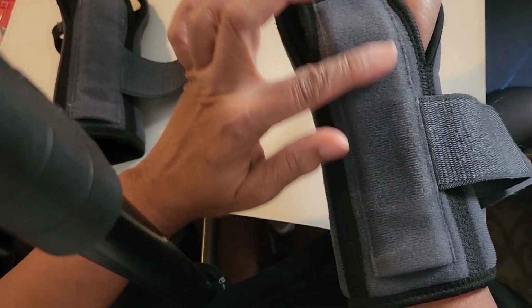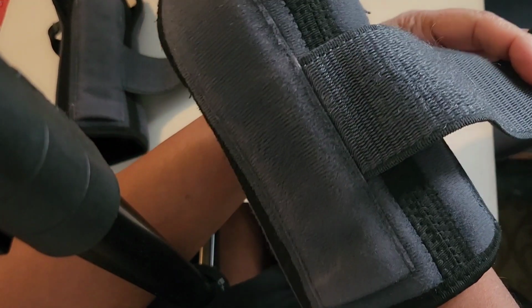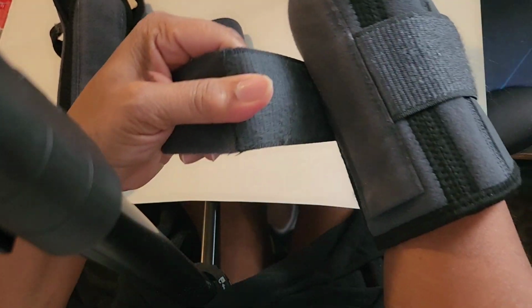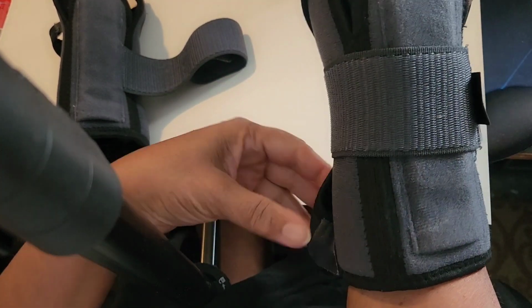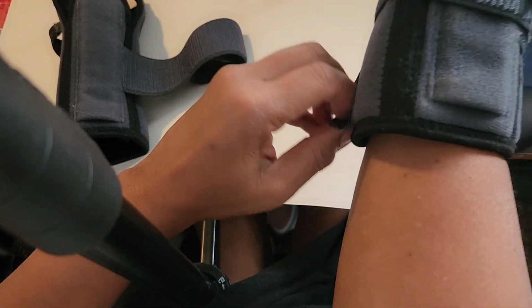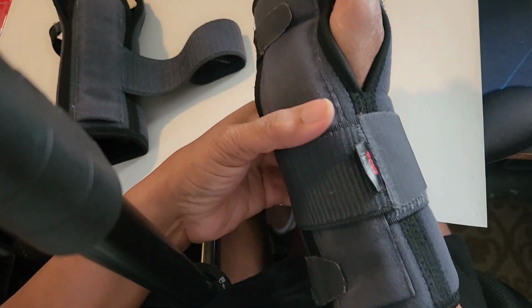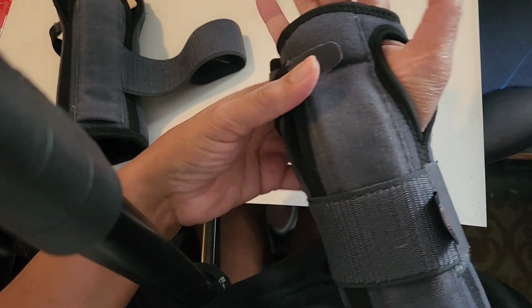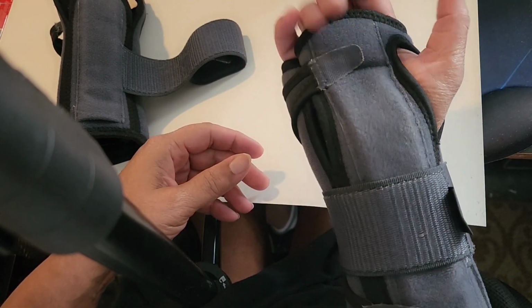So long as that metal part is here on the wrist, you just follow the adhesive, how that works. That feels pretty comfortable. Then this part here, I'm putting snug in, so it's big enough for me. And then there's a bottom part that I can snap to. I don't wear it every single night, but I try to wear it most nights, so I have both the right and left.